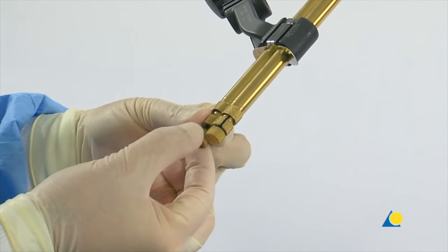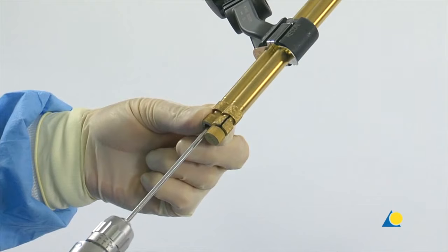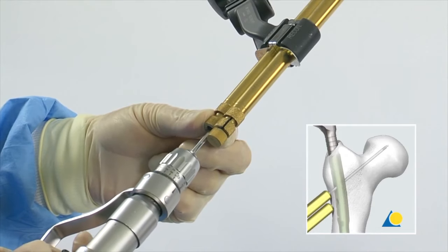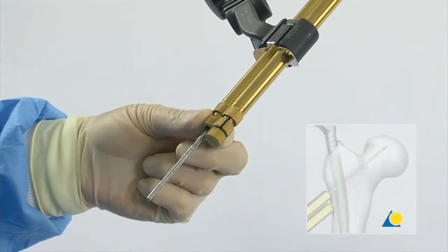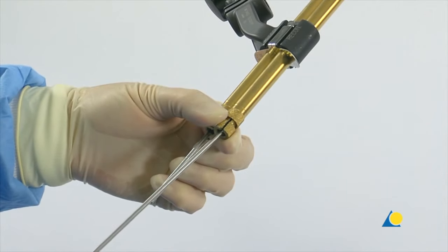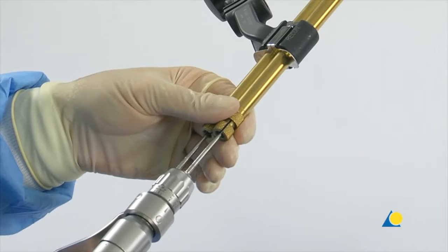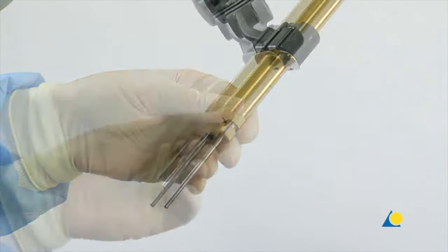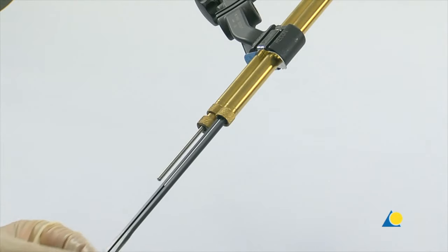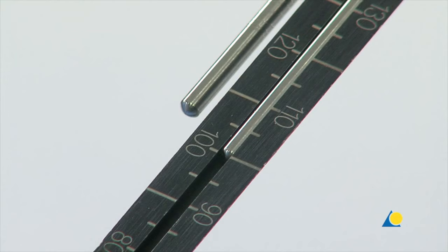The cranial trocar is removed. A 3.2mm guide wire is inserted through the drill sleeve and the tip of the guide wire is advanced to the level of the subchondral bone. In a clinical situation, the depth and anteversion are checked under image intensification in the AP and lateral views. The caudal trocar is removed and a second 3.2mm guide wire is inserted. The drill sleeve is removed and the length of the guide wire outside of the bone is measured with the direct measuring device. Be sure that the tip of the protection sleeve touches the bone or the measurement will be inaccurate. In this exercise, the length of the caudal hip screw is 100mm.